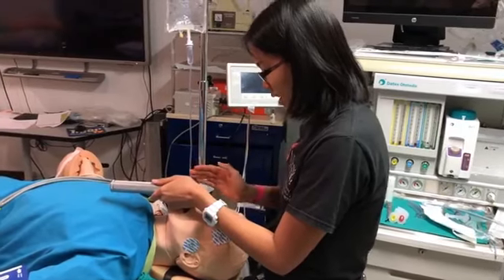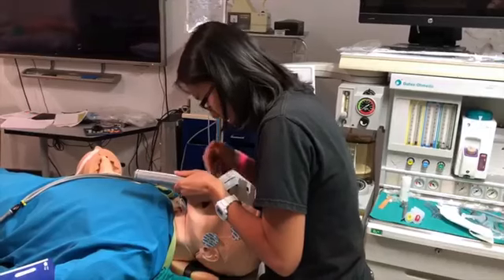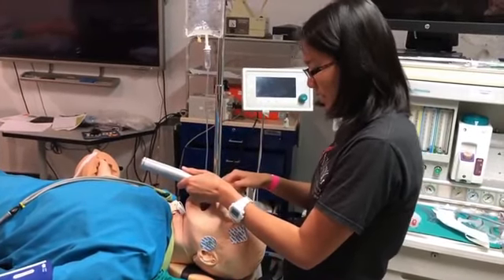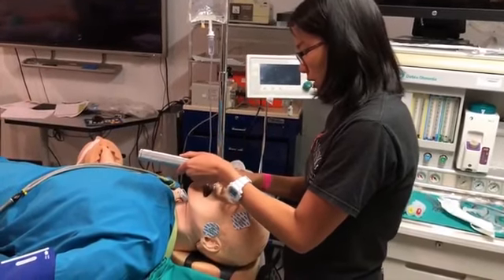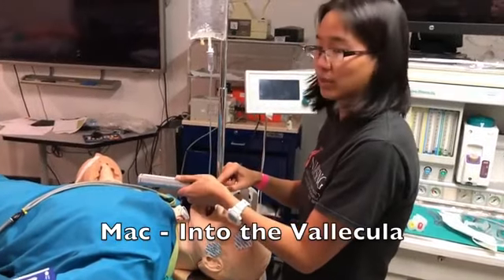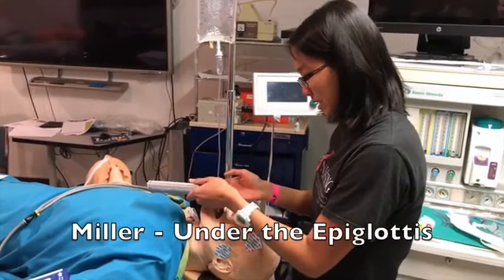Once you do that, you want to make sure to verbalize what you see. I see a hard palate, soft palate, uvula. I see the epiglottis. Once you see the epiglottis, depending on the blade you're using, I'm using a MAC blade right now, make sure you insert it in the right place. So the MAC would be in the vallecula and the Miller would be under the epiglottis.